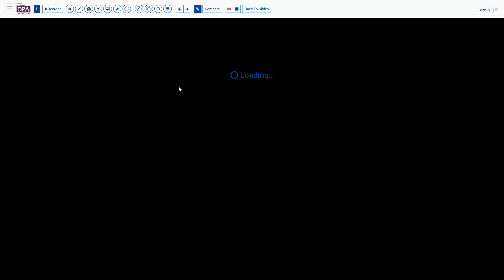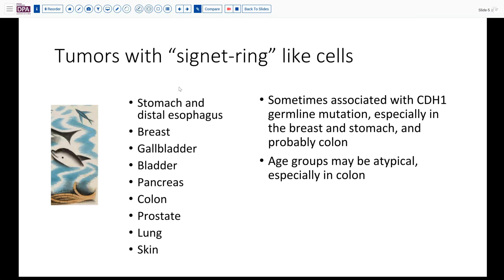When we think about signet ring cells, one of the first things to come to mind is the possibility of metastasis, because signet ring cell carcinoma is not very common in the colon. In terms of relative frequencies, colon is quite far down the list — just above prostate, lung, and skin — and far less frequent than stomach, distal esophagus, breast, gallbladder, bladder, and pancreas.